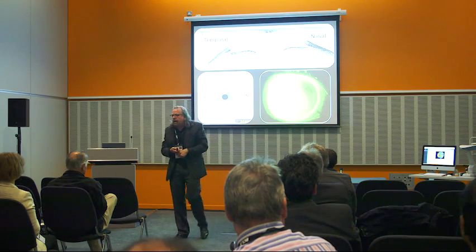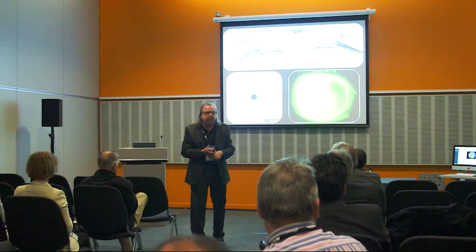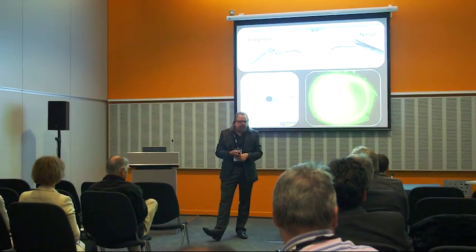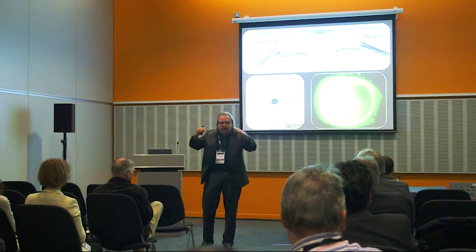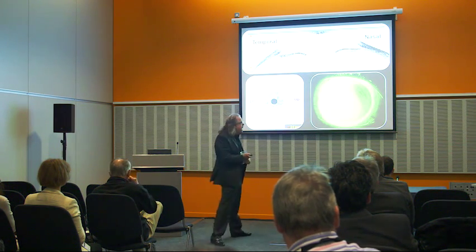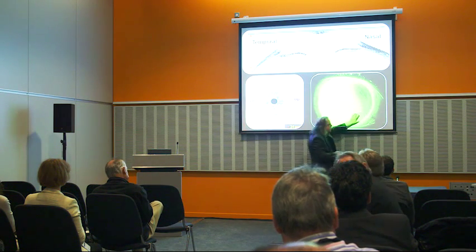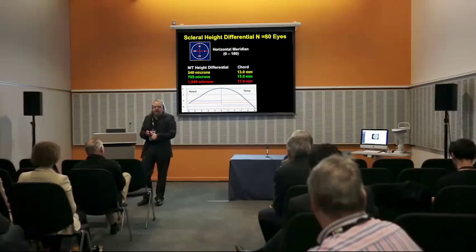Now this brings up an exciting area we need to investigate down the road, and that is asymmetric scleral lenses. That is putting a different tangent angle on the nasal versus temporal sides of the eye, so as to avoid this thinning of fluorescein ever present on that nasal side of the eye.